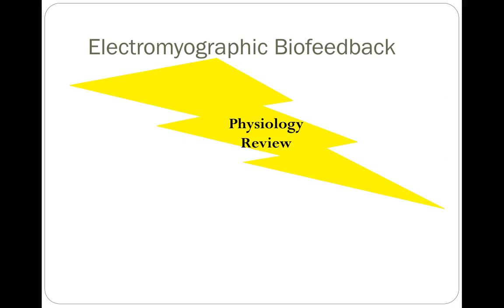The speed of contraction is also influenced by the motor unit. So how quickly do we have to get up to that force needed? As we need it faster, we're going to increase the number of motor units, and they're also going to shift to more of the type 2 fast twitch muscle fibers. So the changes in the potential difference, or the voltage, associated with that depolarization is what we can detect using an electrode put in close proximity to the muscle. That's what we're going to measure, that depolarization. In theory, we're getting more depolarization, which means more electrical activity, with the more motor units that we're recruiting. So that's where we get the inference that we're leading to a stronger, more viable muscle contraction if we can see increased electrical activity.